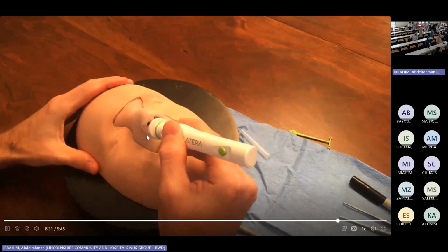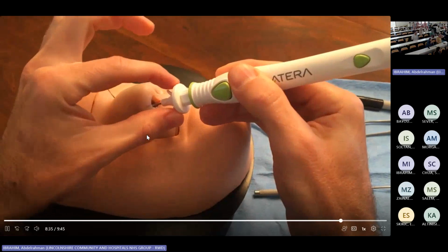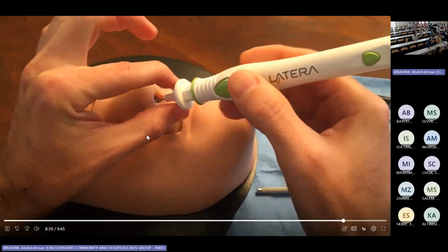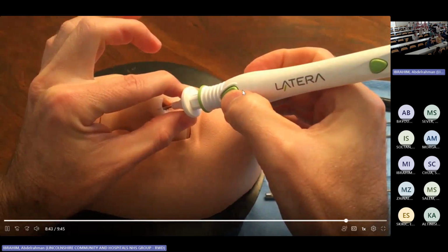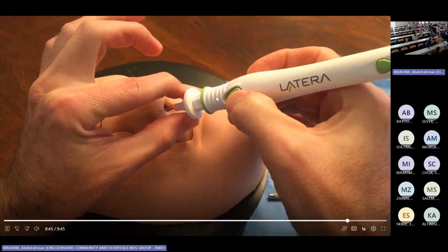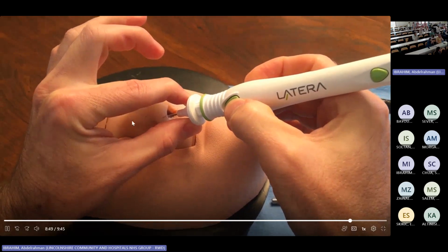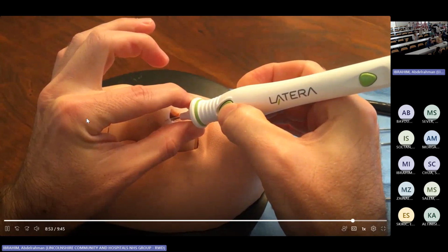So I'm ready to deploy. I will support the nose cone gently with my left hand. I will push the deploy button with my right thumb, and I will advance my right hand forward till I hear an audible click. Click.